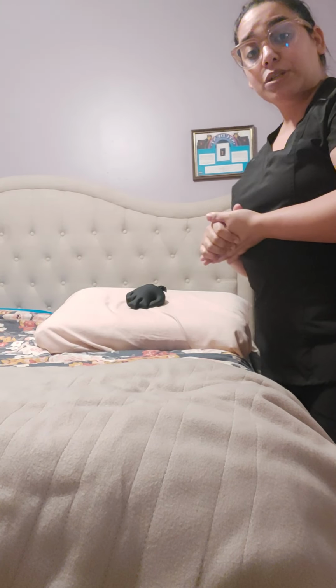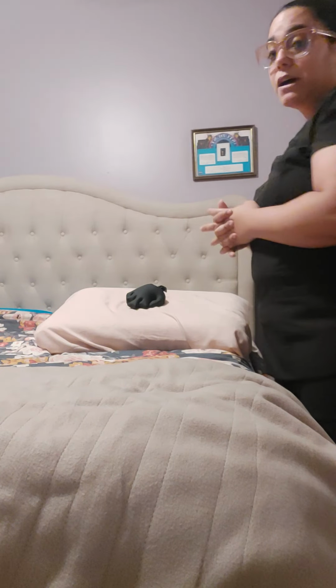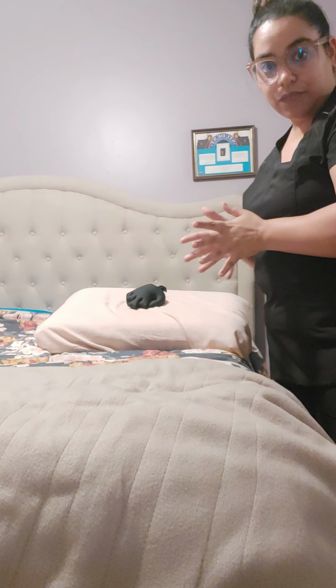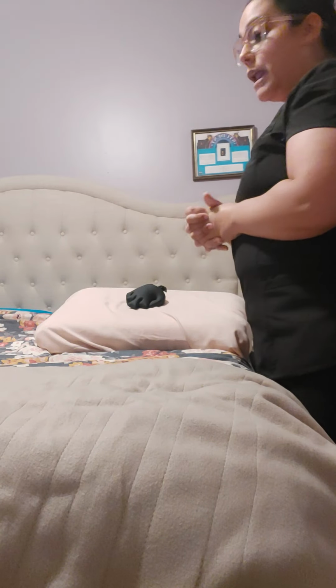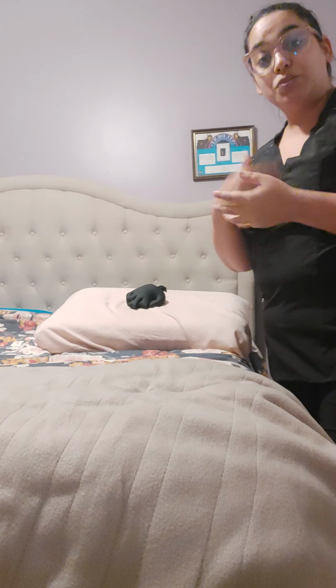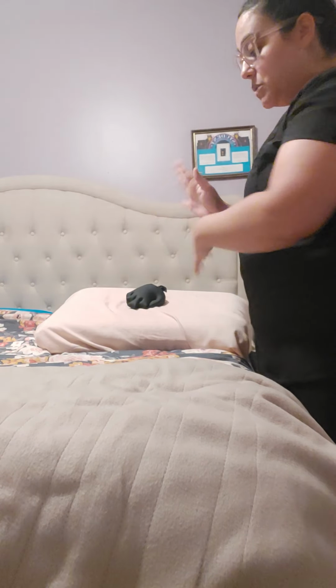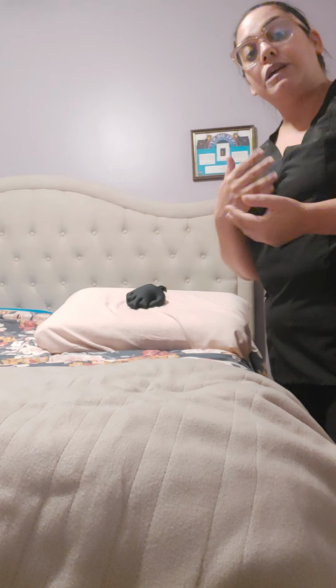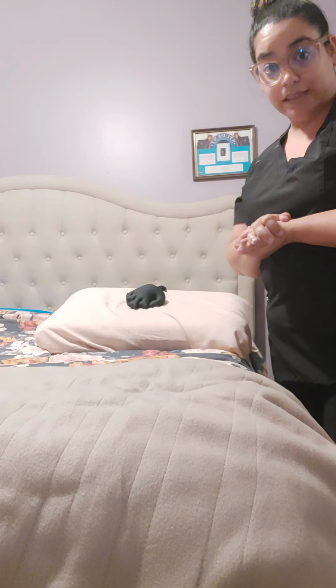I would first start by draping the patient, asking my assistant also to help me in that so that we can maintain privacy for the patient. And then I would proceed to peri-care. I would wash my hands, put on some gloves, do the peri-care for the patient. Once the peri-care is done, I would remove my gloves and wash my hands again.